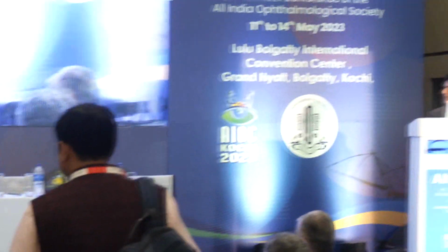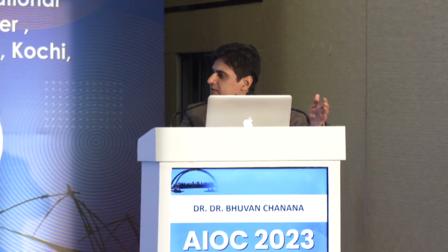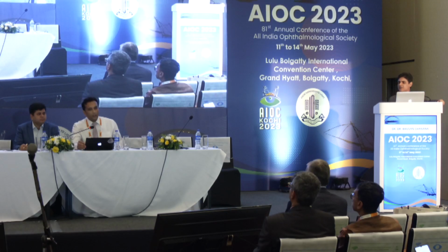Excellent talk, Bhuvan. So I understand what you are trying to say is that your preferred way of doing optic disc pit is just PVD induction and no peeling, with some augmentation of laser at the margin. I think only PVD induction with gas tamponade. You don't do primary ILM peeling in these cases? No, I don't do it now as a routine procedure since I developed macular holes and trauma to the disc. The stuffing, yes, I will not do as a primary procedure. Stuffing, I'll definitely not do.